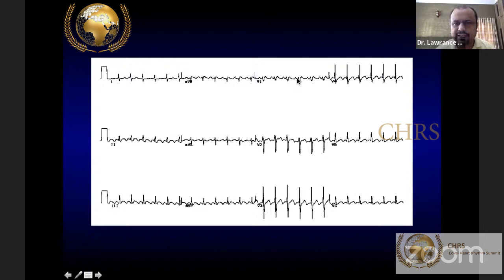You are looking just like a sinus rhythm P wave kind of a thing, but you go and look at your inferior leads, it's clearly showing a sawtooth pattern. Sometimes this may be confusing. I always say whenever you see a tachycardia which is 150 beats per minute, you should always be careful about atrial flutter, because in atrial flutter, the most common conduction is a 2:1 conduction. So when you see a tachycardia which goes at 150 beats per minute and you look at the screen, each and every beat is 150 beats per minute.